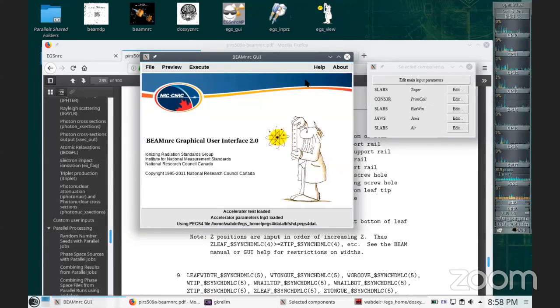And this is where you're probably going to spend a lot of time, because how are we going to make sure our linac properly matches the linac in our department? You can't easily, because usually vendors will not give you the exact geometries. You will be lucky if you get them. So you have to start to tweak. You have to say, okay, maybe the energy of electrons is 6.1, maybe it's 6.05, maybe the beam actually is not 1 millimeter radius.